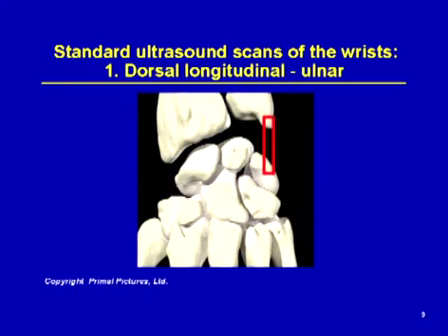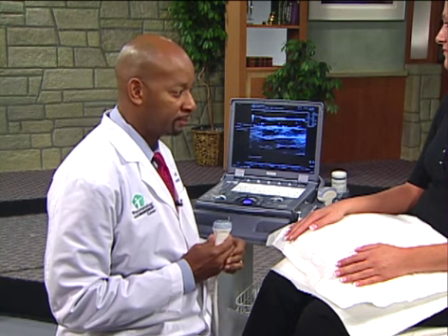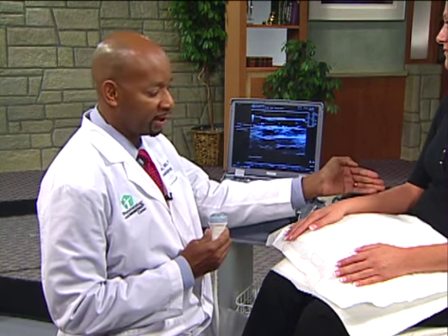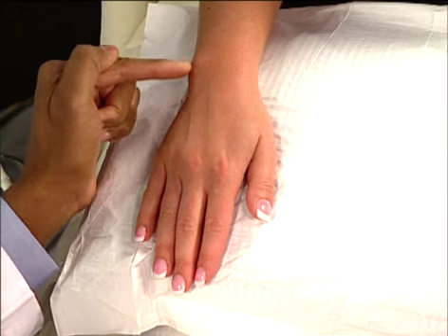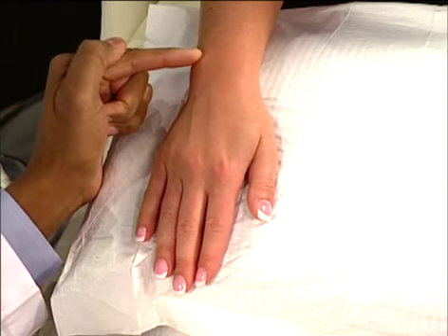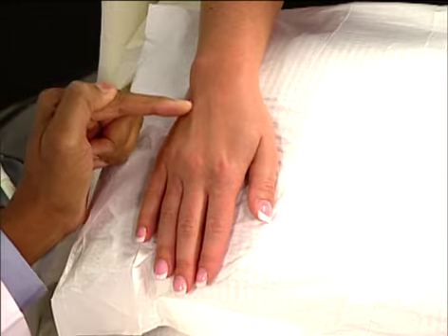The first standard scan is a dorsal longitudinal scan looking over the ulnar aspect of the wrist. Now let's move to the model so I can demonstrate these on the ultrasound machine. Let me review with you the position of the patient. I like to have the patient seated at an examination table with the elbow flexed 90 degrees and the hands resting on a small pillow, so I can easily access the dorsal or the palmar aspects of the hand.